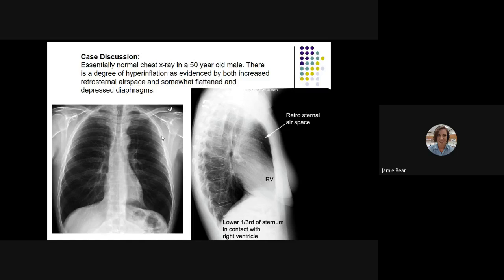Think about that for imaging and pulmonary function testing. A restrictive component, such as pneumonia, atelectasis, or ARDS, is where the lungs become stiffer. A lot of times they fill with fluid and it's harder to get the air in, and that appears more radiopaque, so less air in. Does that make sense?